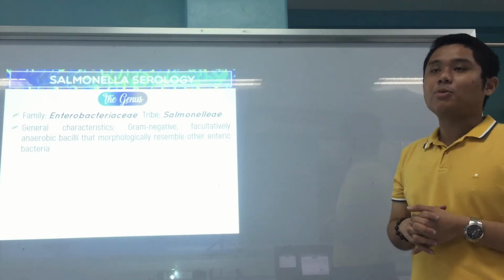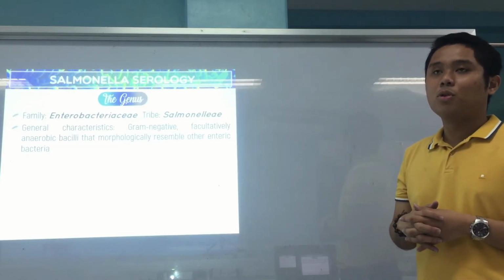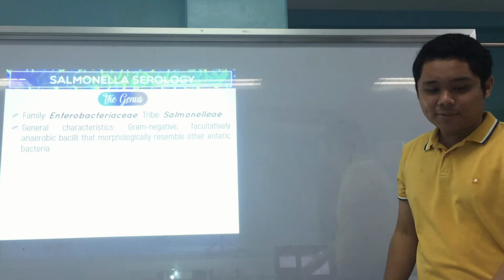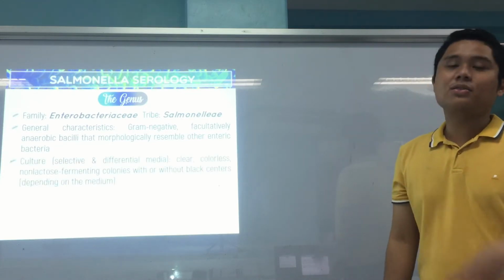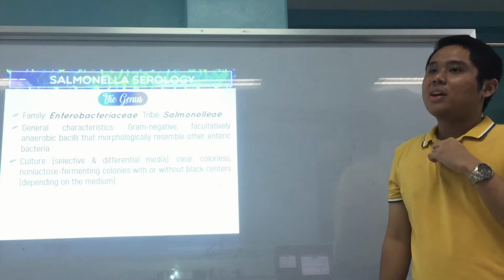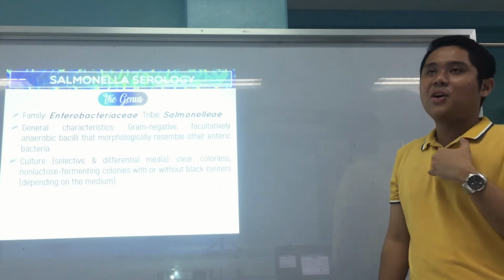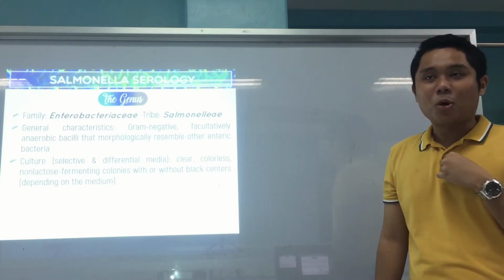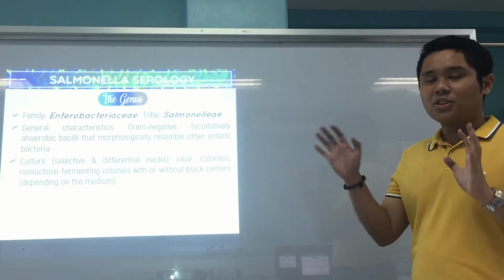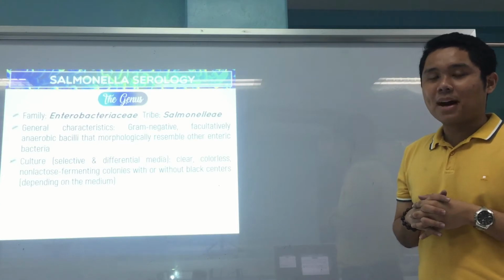Of course, your Enterobacteriaceae, most of them look the same. Gram-negative, facultative bacteria. For culture media, for Salmonella, there are many. You have BSA, you have SSA, you have XLD, you have HEA, Hektoen enteric. These are all Salmonella and Shigella agars, which differentiate the two.